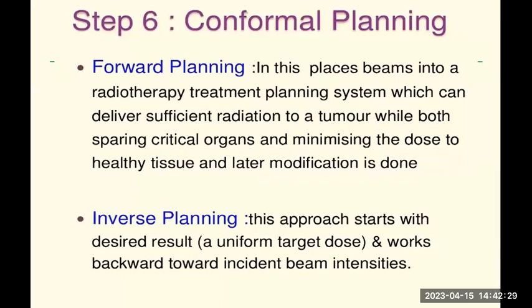In the first category, forward planning, when the beam is delivered to the tumor place, it always spares or minimizes the dose to the healthy tissue.